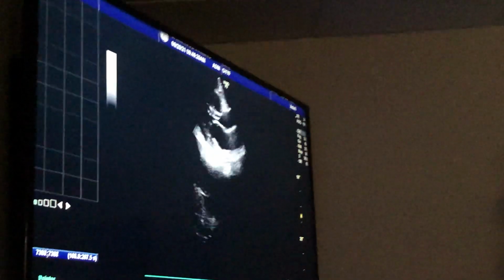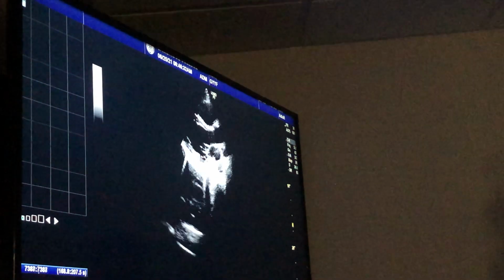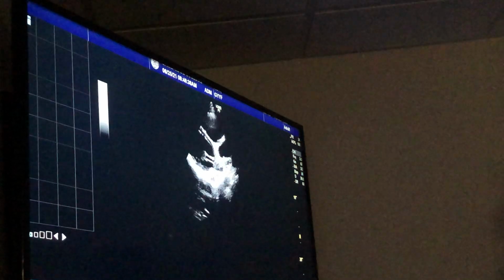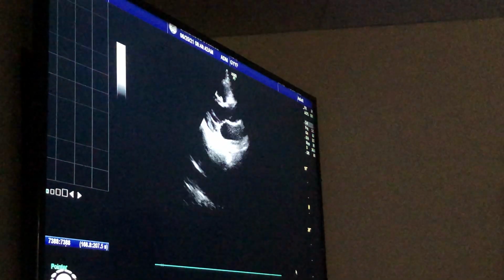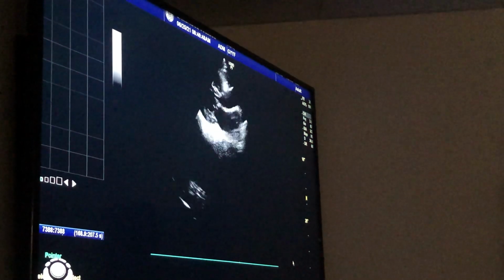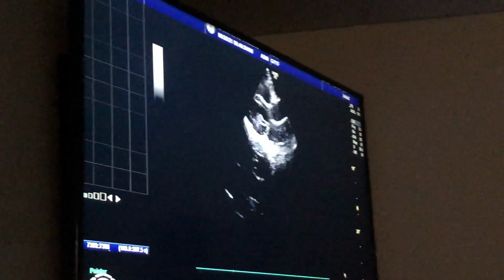and we clip that. It's plugged in, but for some reason, hang on a second. I don't know why the EKG isn't. It's on. Anyway, moving on. We'll have plenty of time for that.